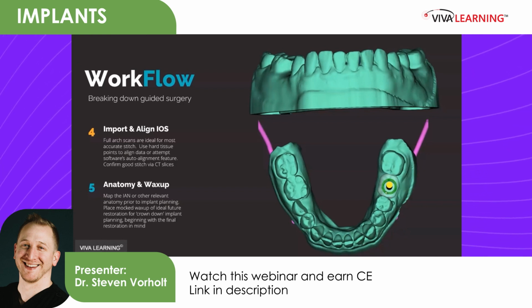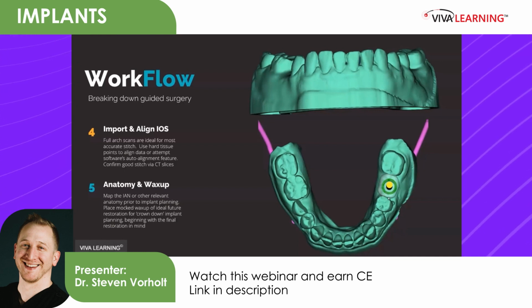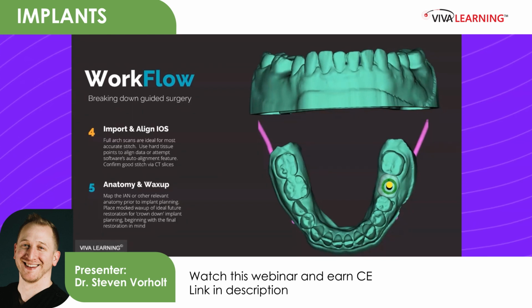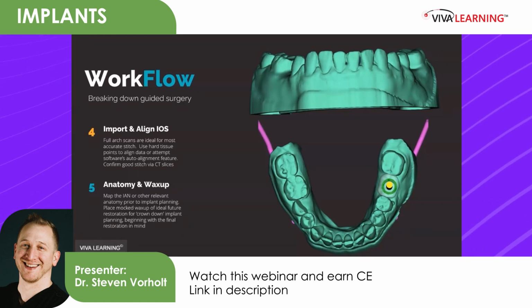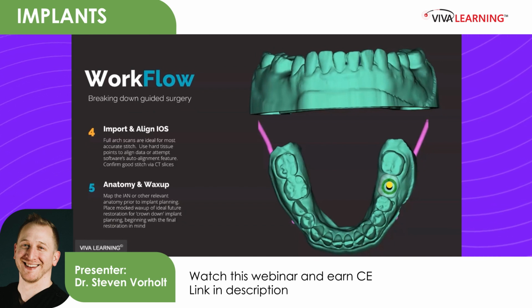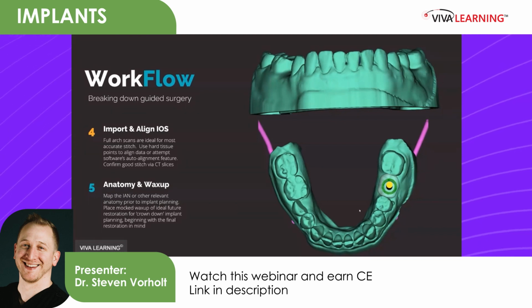Now, most of us here that are watching this right now can do this kind of wax-up in our minds. That's not that hard, and I'm totally fine with that. Like, you can certainly imagine, okay, somewhere between 18 and 20 is number 19. It's not rocket science. But if you're doing something like a bridge, or certainly if you're doing a full mouth, you really ought to have a pretty clear idea of where the teeth are supposed to be in space to give yourself the best options.